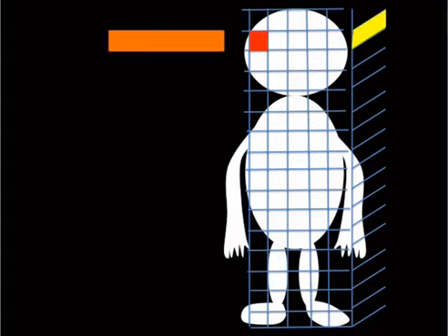Localization gradients have identical properties. They're just applied at different times in different directions. Because you have three gradients and three planes, you can localize anything in the body.